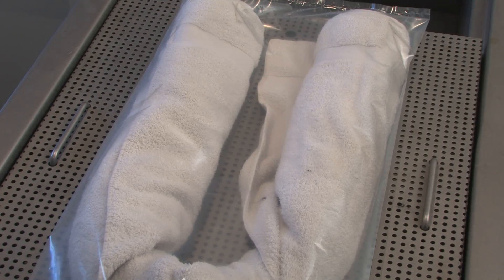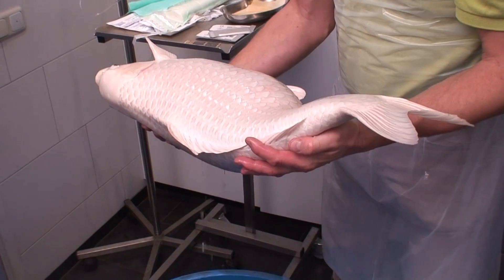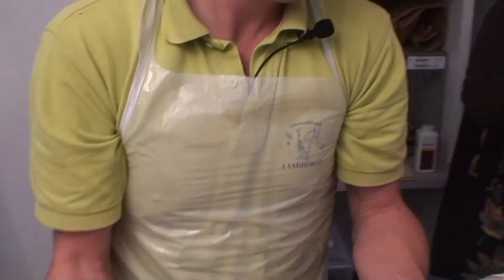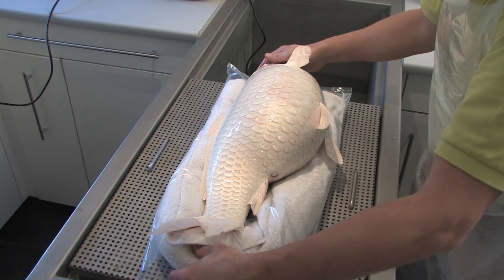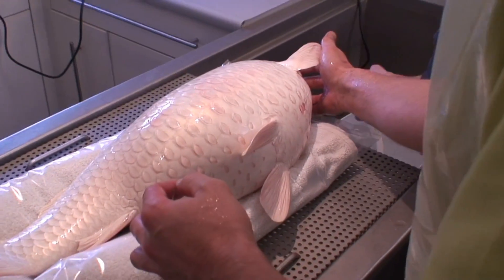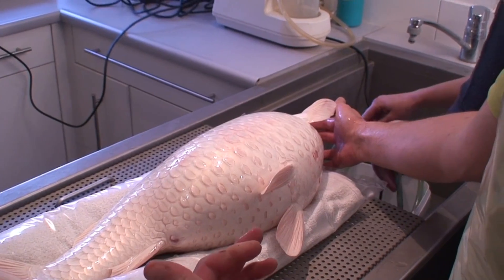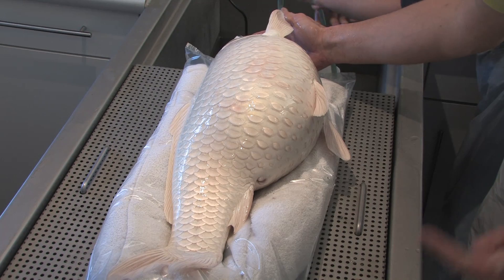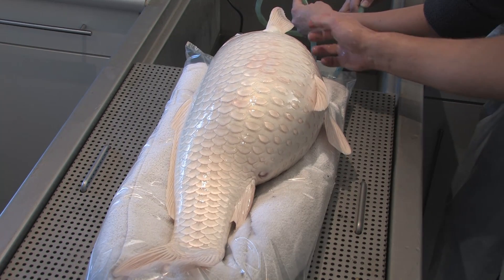First of all, we change the cameras so that no one falls in the tank. Then we take the fish out of the tranquilizing water and put them on the table to prepare the skin for the surgery. We have to check at the same time how the reflexes are — is he still breathing? Yes, he's breathing. Does he move? Not yet. So here we are going to prepare the fish for the operation. Before surgery, we give him medication against pain, antibiotics, and vitamins.